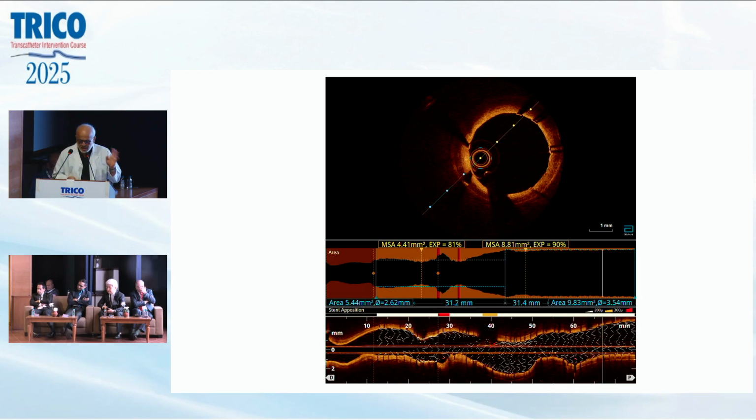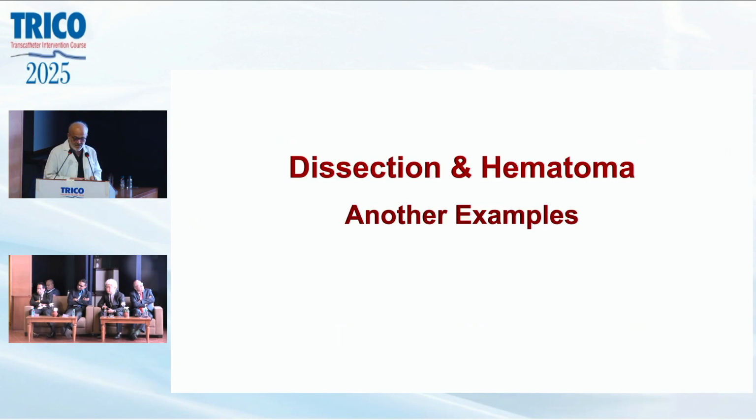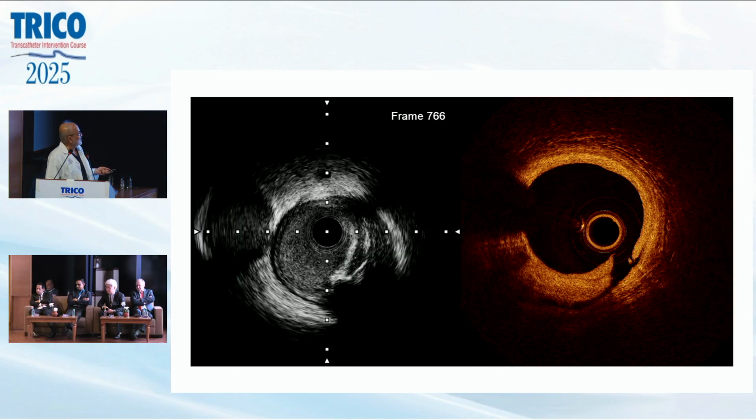But there has to be a strategy for this type of cases. Again, a few more examples from IOPUS, our investigator-initiated study, simultaneous IVUS and OCT. This is a big dissection. Professor, this is a medial dissection, right? Dissection, yes. Always to be fixed.